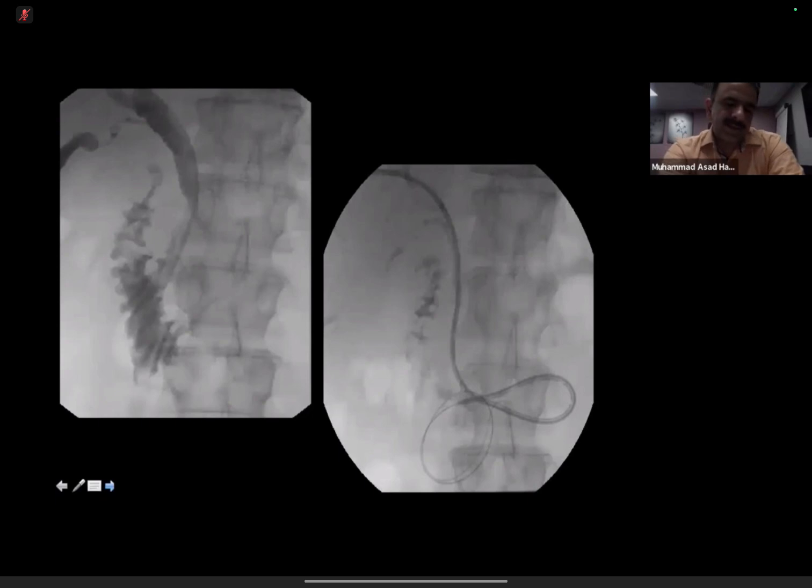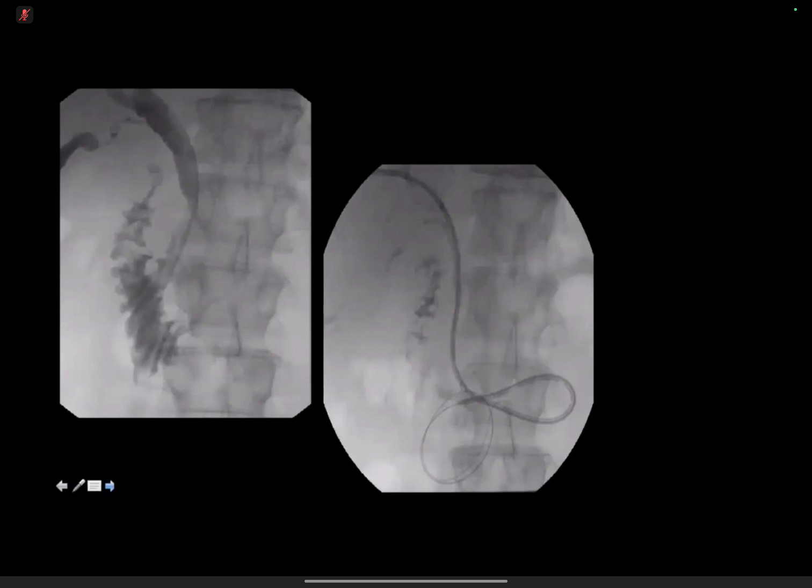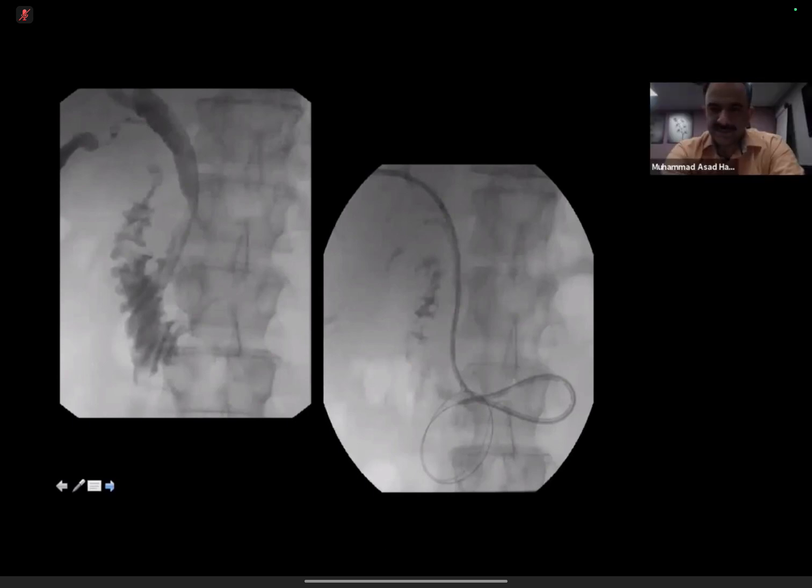The one thing which you can do, and that quite frequently helps in the diagnosis, is you can collect the bile for cytology. The collected bile is sent for cytology, and cholangiocarcinomas fairly routinely can be diagnosed from that. Also, if you are unable to collect any bile or it's non-diagnostic, you can do some brush cytology.